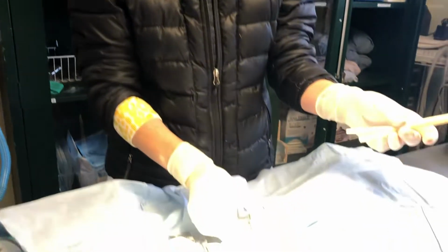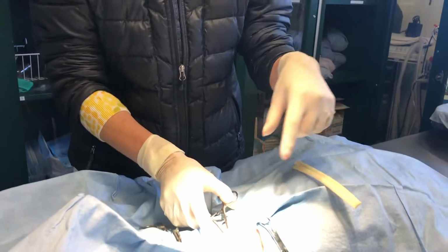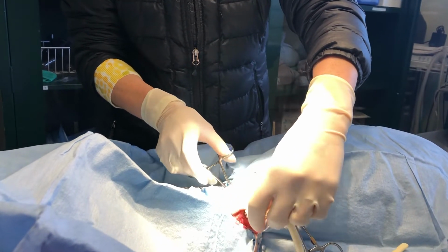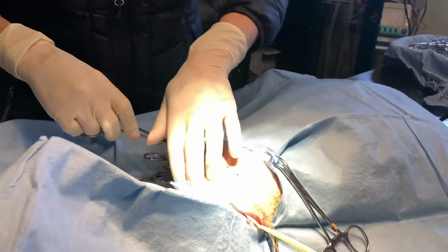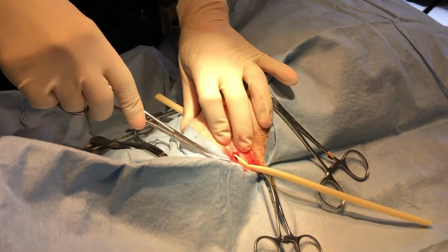So this is a Penrose drain. It comes in multiple sizes, and I'm on either end of the pocket. His head is here, his back end is here. So I'm gonna put this plastic drain in. You wanna have an entry and an exit. Sometimes we don't actually do an exit, but this guy is kind of gravity dependent. So this is going through his abscess, and this will allow us to flush around the drain, and then we're gonna put him on a different antibiotic.